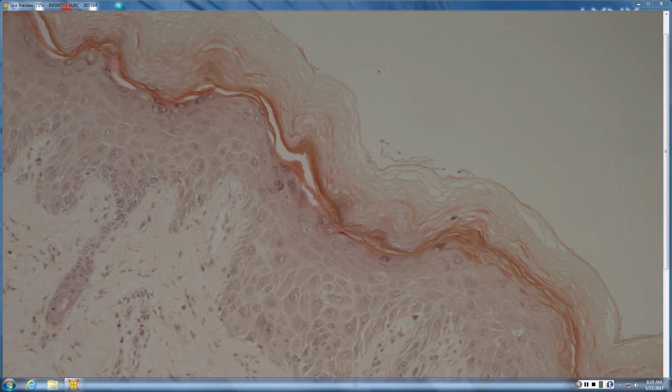Like drug? Yeah, and that would be typical for toxic erythema of chemo. So toxic erythema of chemo, also called acral erythema of chemo, because it tends to be hands and feet, looks sort of like grade 1/2 GVHD. So you have often loss of the basal layer, but it's pauci-inflammatory. That disconnect of pretty dramatic loss of the basal layer with very little inflammation is kind of typical for the toxic erythema of chemo.